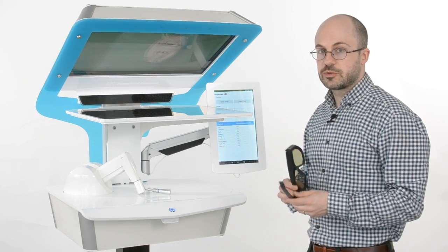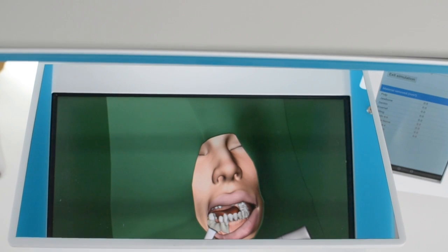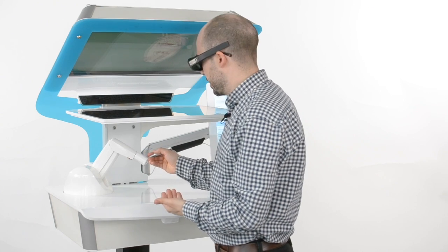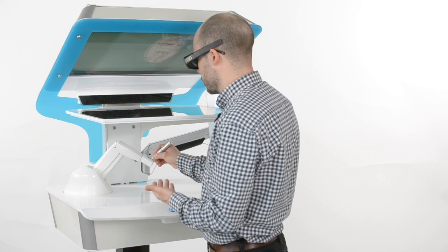So now I put on my 3D glasses and I look down here below this mirror. The purpose of the mirror is to enable me to actually feel the teeth and bone where I see them — they are co-located.